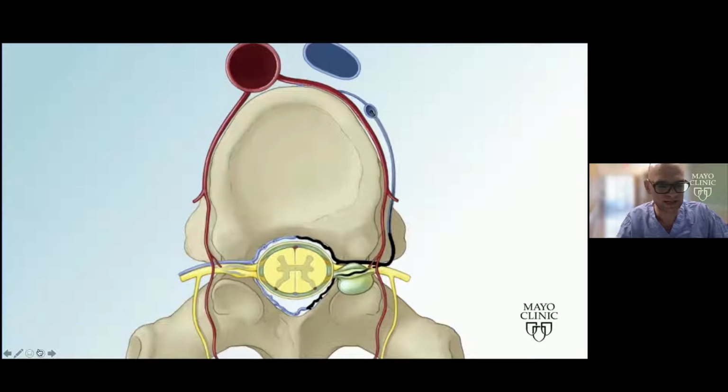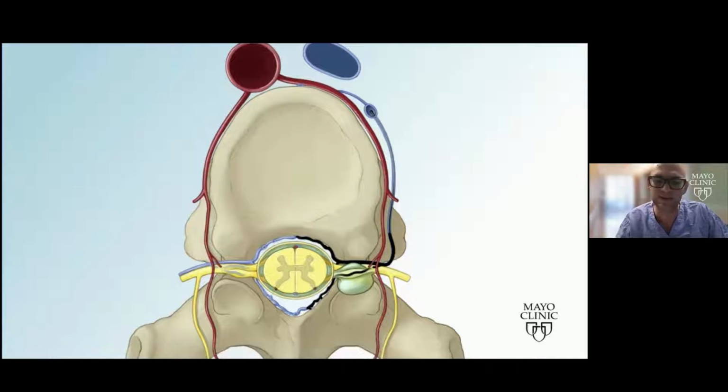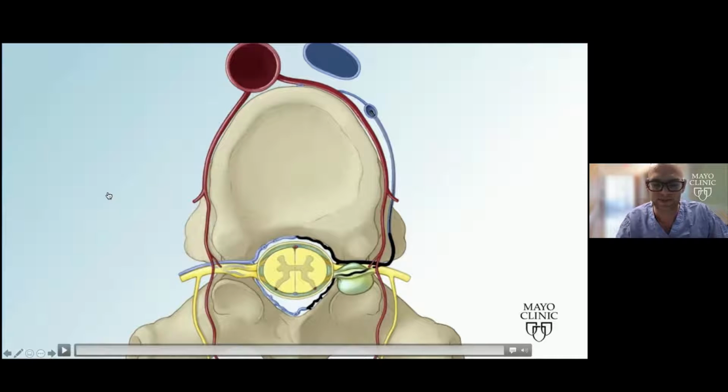This shows some of the anatomy. We have our paraspinal vein, which is one of our embolization targets, then the veins in the foramen, the foraminal veins, and also the epidural veins, because the goal here is to occlude any route of egress of the CSF venous fistula.